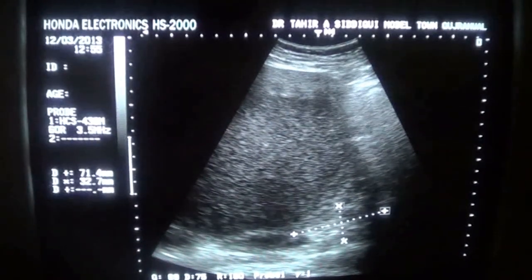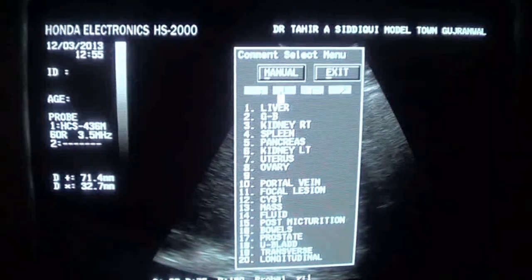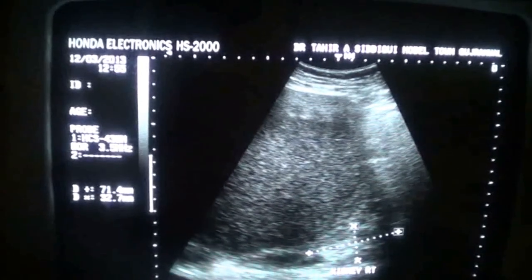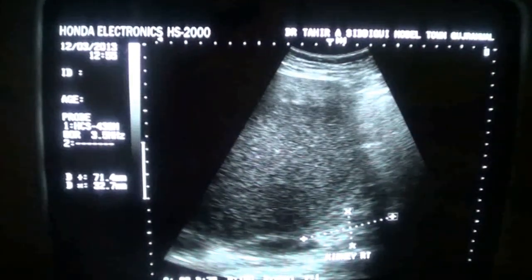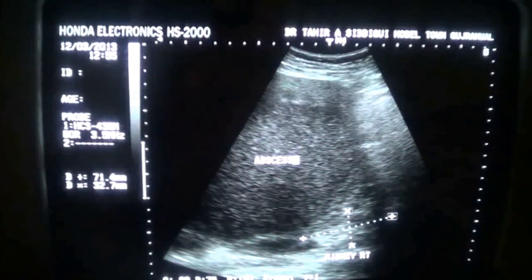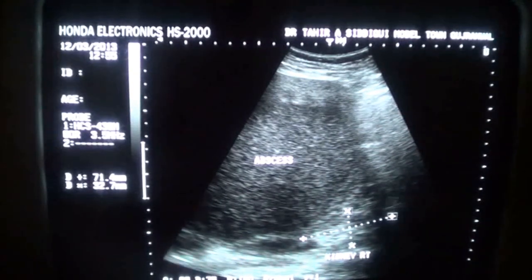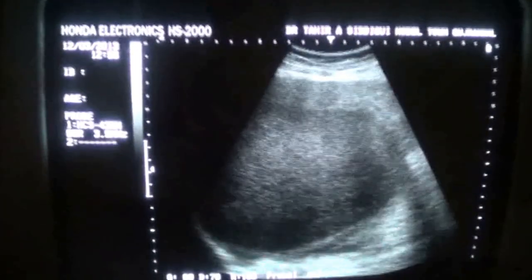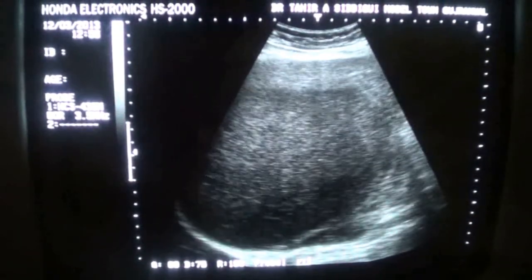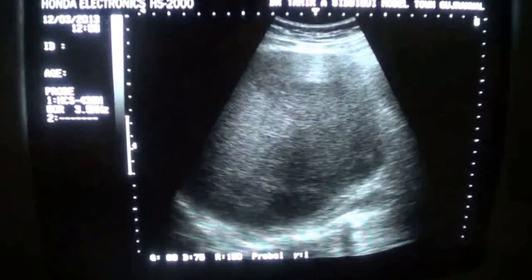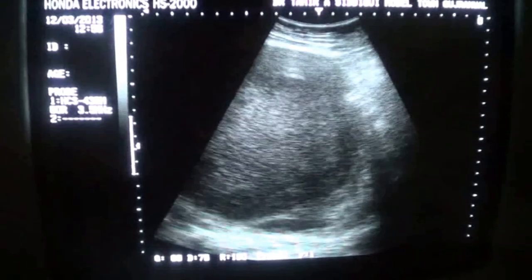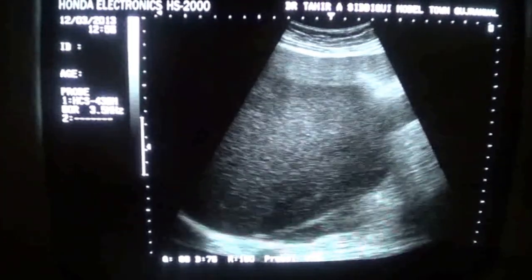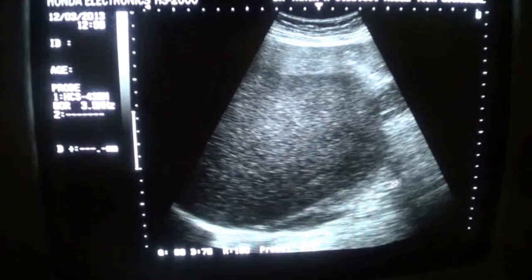So this is the abscess in the right kidney. Most probably it is going to be a cold abscess and it is a perinephric abscess, which has displaced the kidney downwards and has a pressure effect on its size. On this location you can see the psoas muscle — this is the psoas muscle, right psoas muscle.